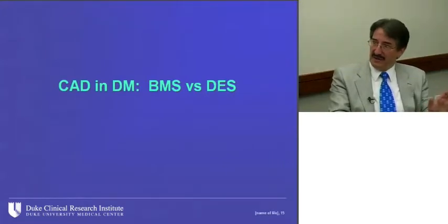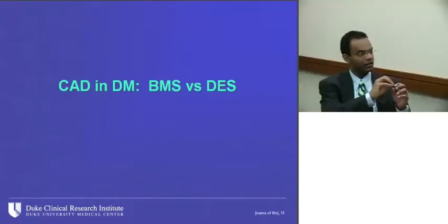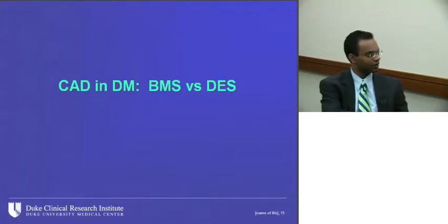And from the substrate, once we identify that they have coronary disease, to how the coronaries and clinical outcomes respond to percutaneous intervention. So Mitch, is it fair to say then that the high rates of restenosis in the diabetic patient is probably multifactorial? It's above and beyond just the fact that they have small caliber vessels. We know the vessel diameter, for example, is such a big predictor of restenosis.